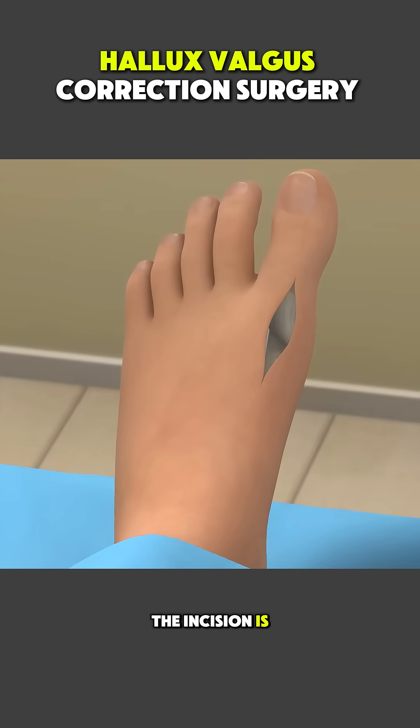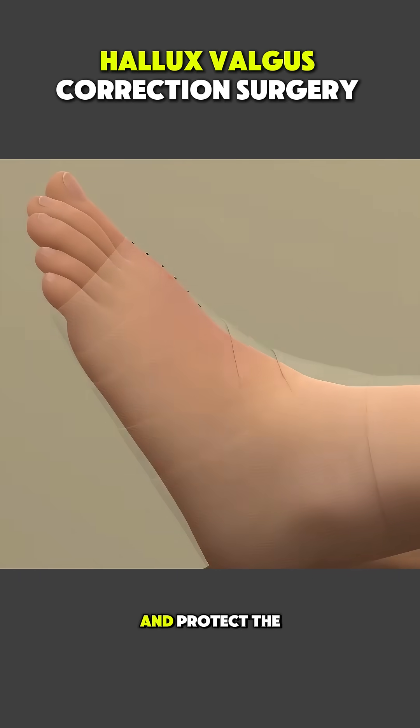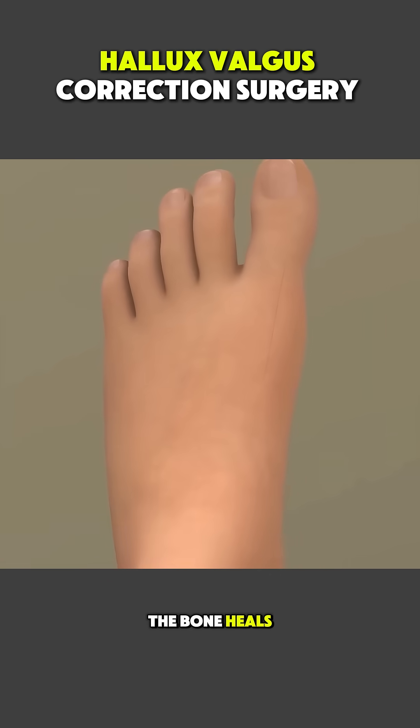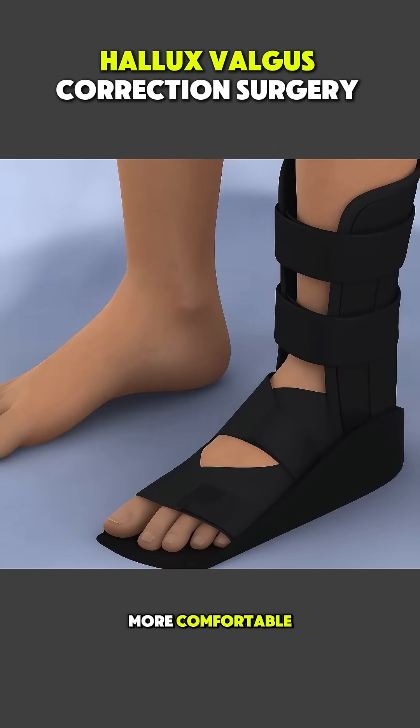The incision is then closed, and the foot is bandaged to control swelling and protect the correction. Over the next several weeks, the bone heals in its new position, pain gradually decreases, and walking becomes more comfortable.